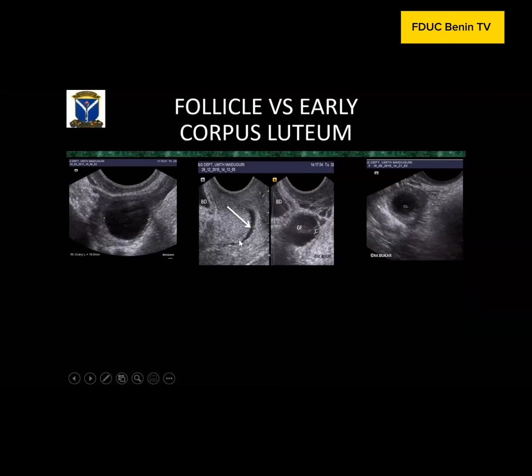And if you look at the cervix here, you can see the cervical mucus is clean, it's clear. This is where you demonstrate the spinnbarkeit. So you can see the feature here is consistent with what you have here. So to me, actually, this appearance is like the ultrasound scan equivalent of LH, because 24 to 36 hours after the appearance of cumulus, the ovulation will take place.